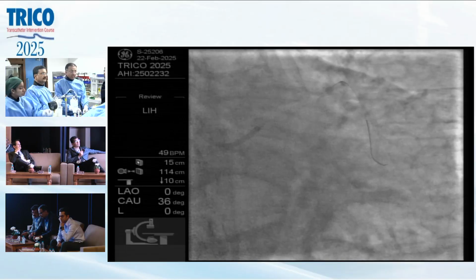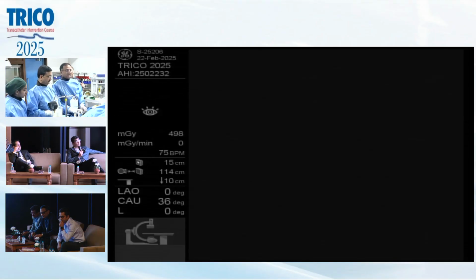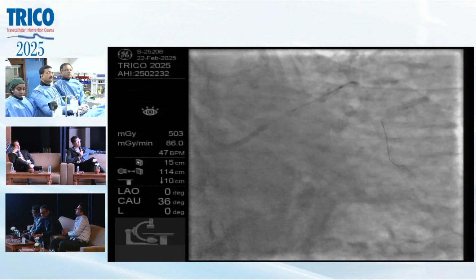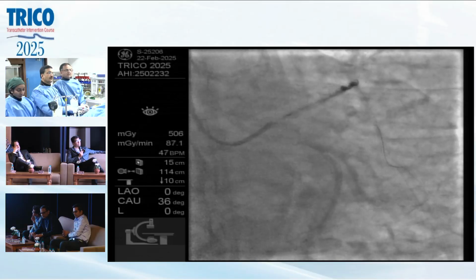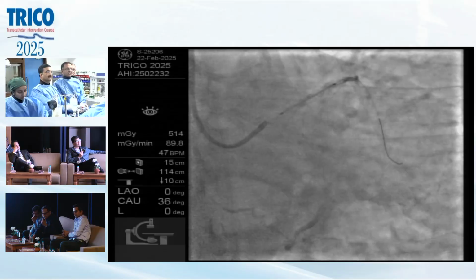So Samir, there's a question from one of the panelists. You are seeing a lesion at the ostial LAD. What's your plan to do about that? I don't know if you noticed that on the OCT. So we looked at the OCT when it was being done carefully with as far as the ostial.